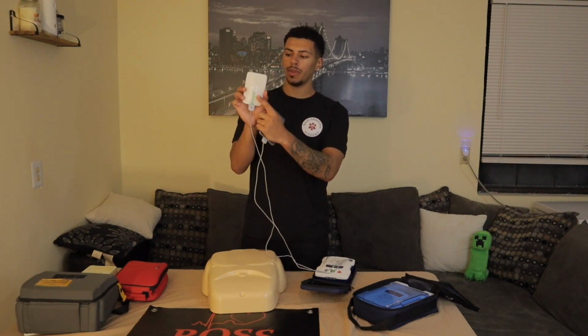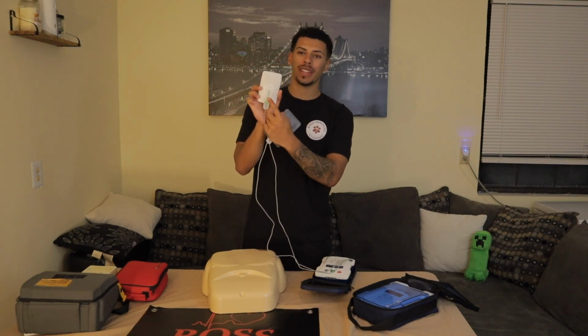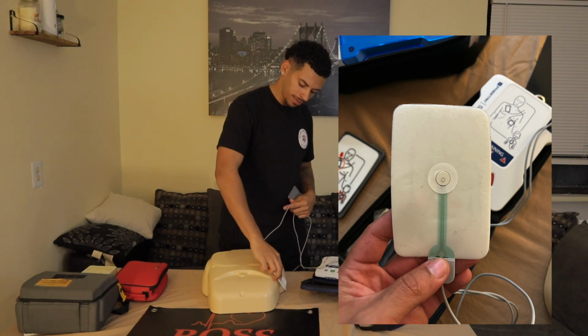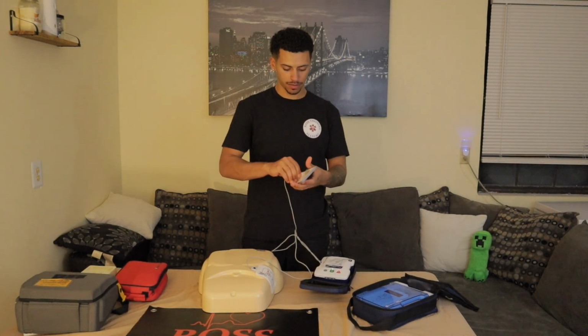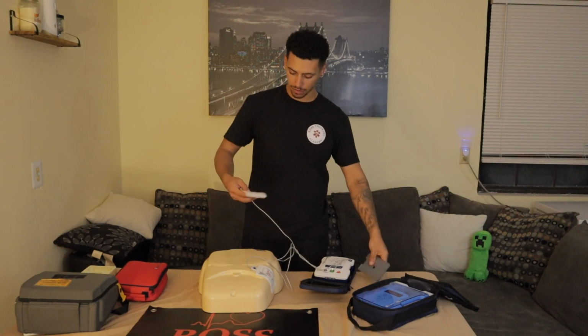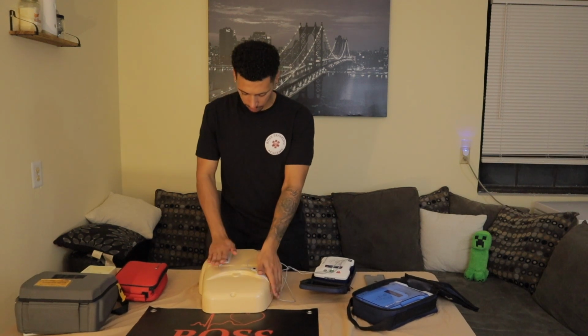And on this pad, there's going to be a little sensor.